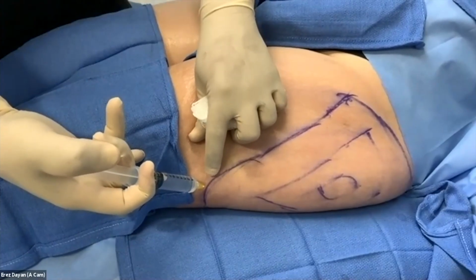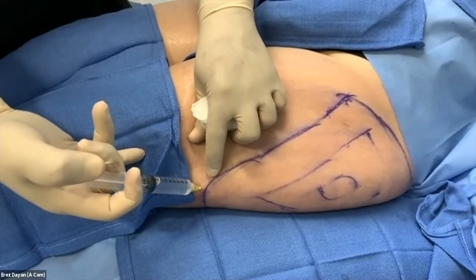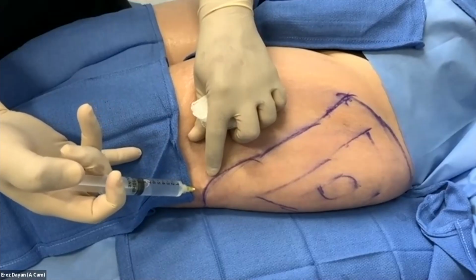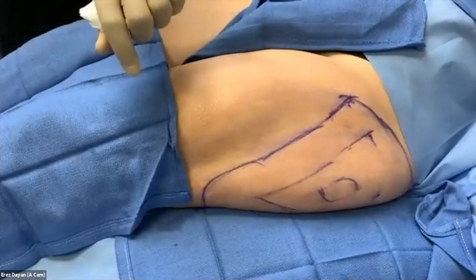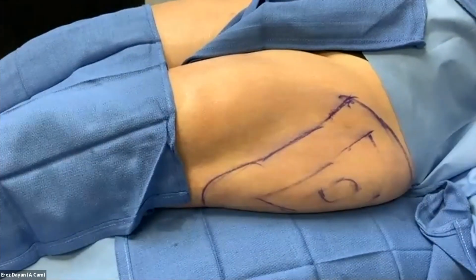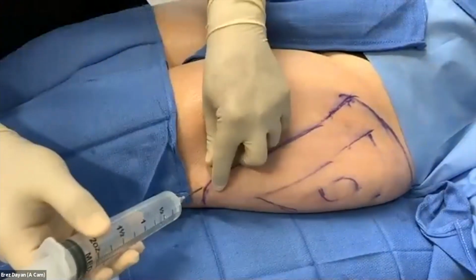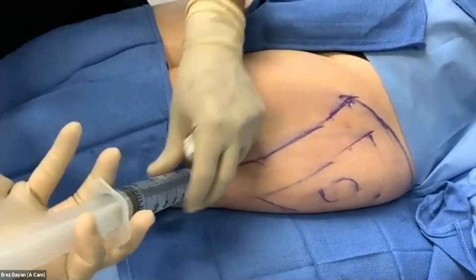Because I'm going to come in with a 14 gauge needle and I don't want to miss that spot, what I'll typically do is then come more superficial and cause a little bleb just to indicate to me where I'm at. So I'm kind of right there. Then I have a 60 cc syringe with tumescent in it. So this is a 14 gauge needle. I like to create just a wheel. So I'm just going to go straight in and infiltrate tumescent.